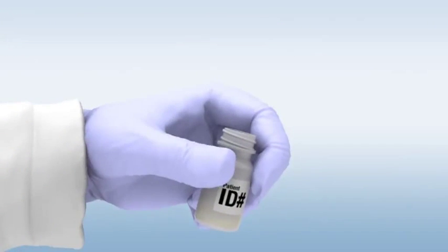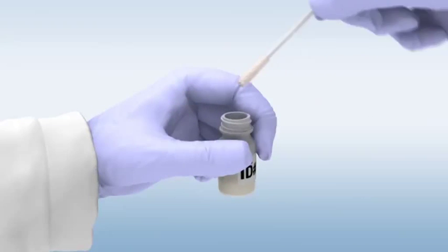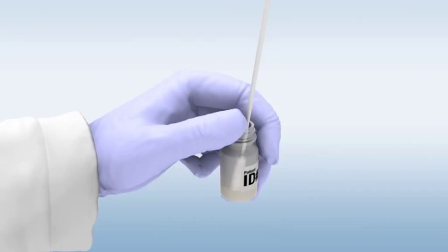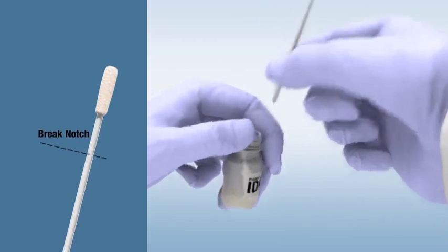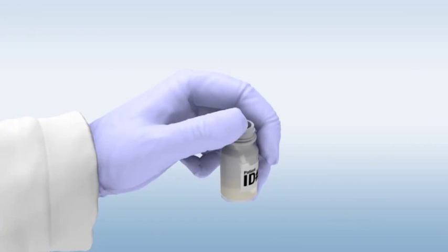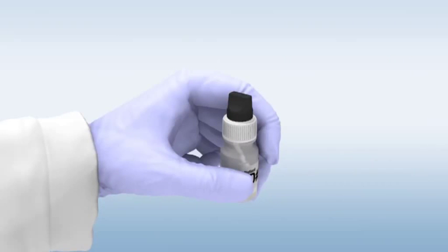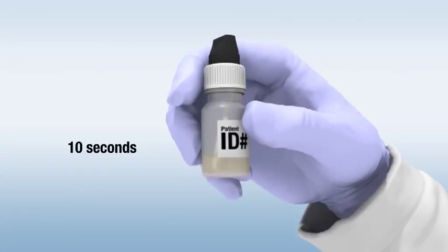Place the collected sample into the labeled black cap sample tainer. Ensure that the swab rests on the bottom of the bottle. Gently break the swab by applying pressure to the shaft at the brake notch. Place the white cap with the upper black cap back onto the sample tainer containing the swab tip. After securing the cap tightly, gently shake the bottle back and forth for 10 seconds. The sample is now ready for testing.